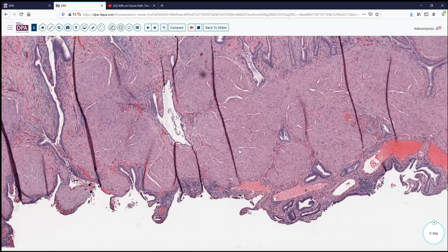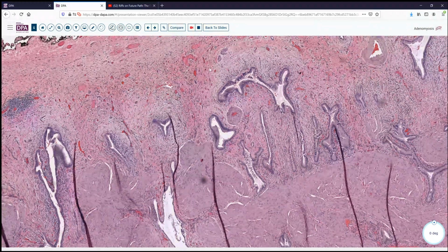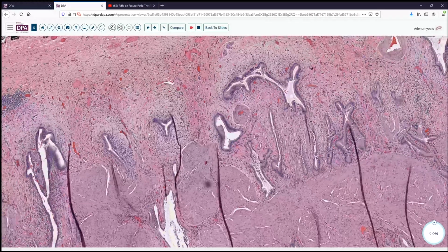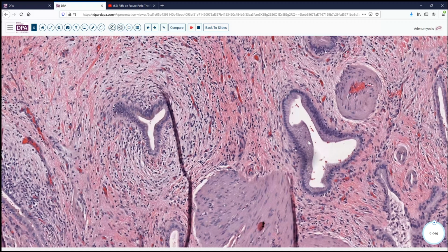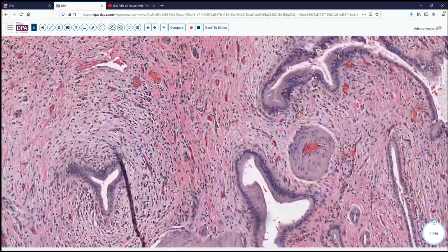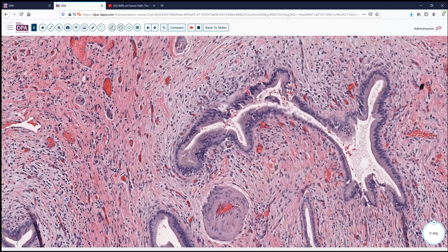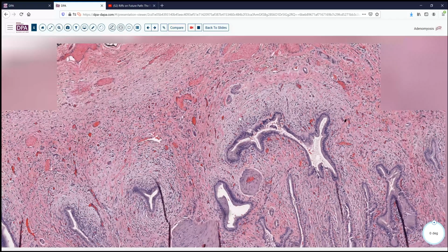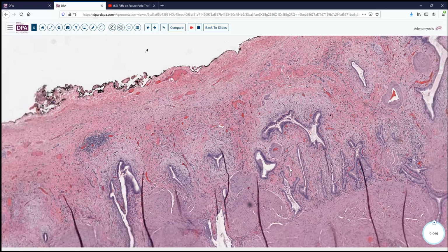We have some vascular ectasia here. And then let's compare that to what we're seeing down deeper here in the wall, where we're seeing this desmoplasia and inflammation. Now, granted, these glands are somewhat misshapen. They're triangulated or branching sort of things. But if we compare this epithelium, it is virtually identical to what we were seeing on the surface. So if we have surface dysplasia and we have this type of tissue in the Aschoff-Rokitansky sinuses, and we begin to see this type of stromal desmoplasia, it's very easy to jump to a diagnosis of invasive neoplasia.